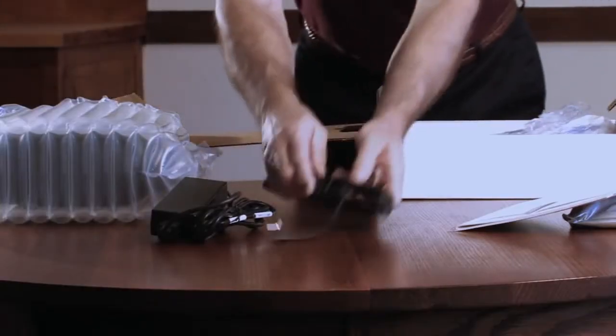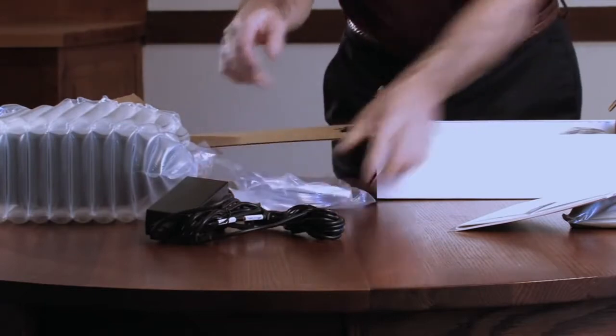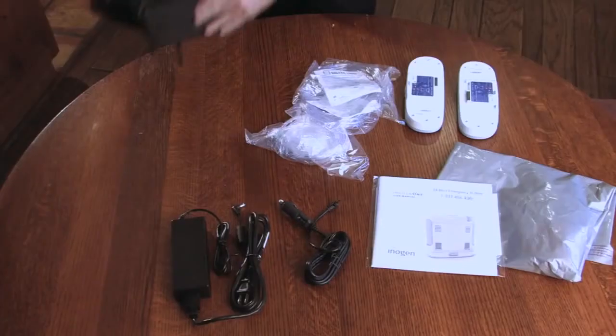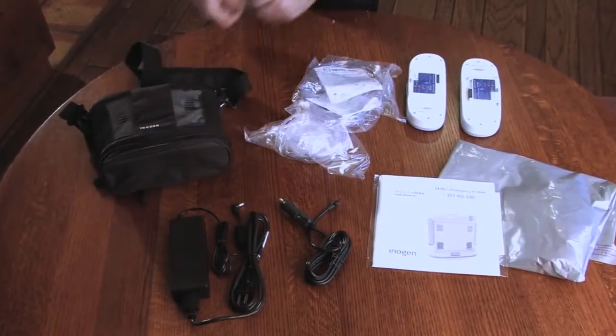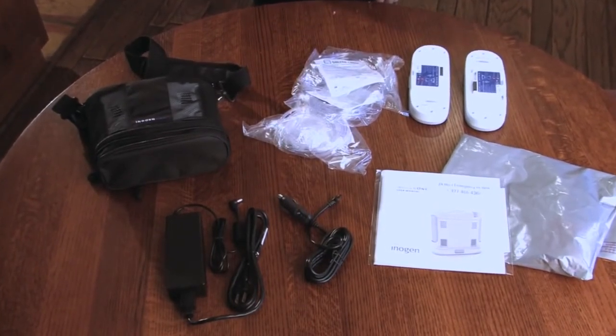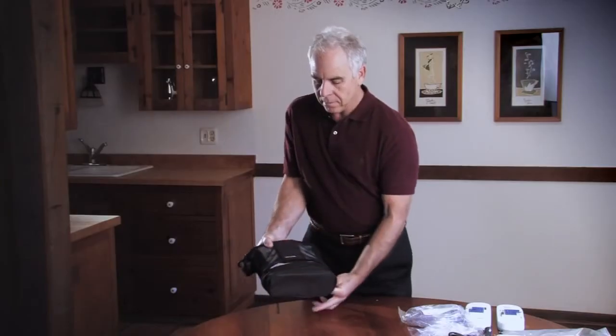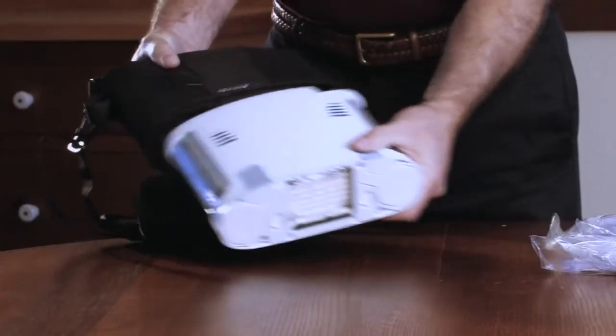Getting started with the Inogen One G3 is easy and requires no additional tools or expertise. Now that you have unpacked all the contents from the box, you have everything you need to get set up. First, remove the Inogen One G3 from the carry bag.